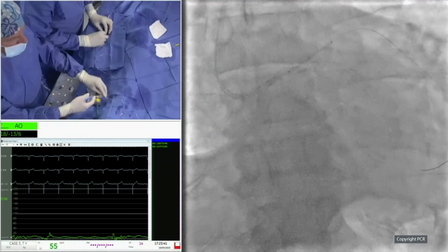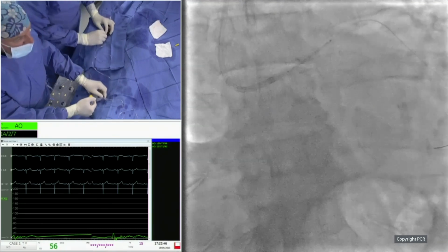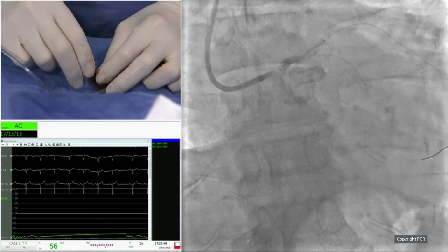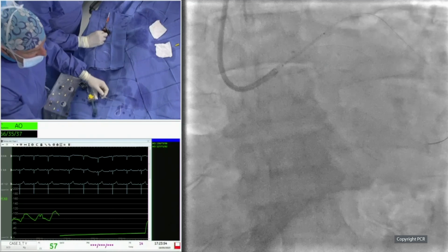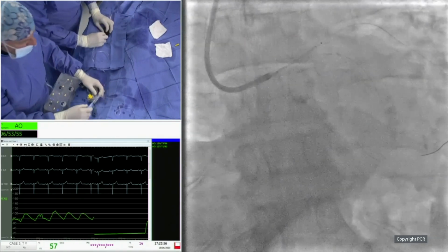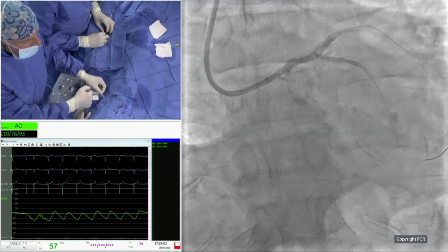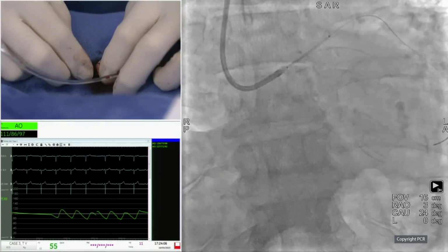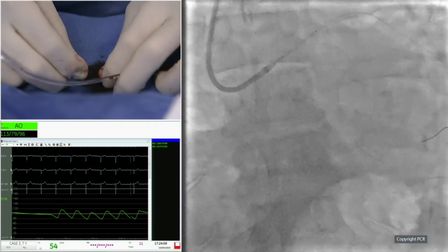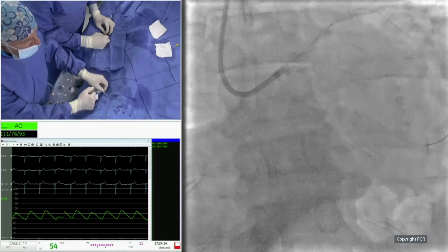The stent. So it's a 4.0 by 20 millimeter Supraflex. Maybe you have to advance it a little bit. You see, 20 was enough for me. I hope we will not have a distal dissection, but I chose the 40 due to the. Maybe we have to advance a little bit more. Yes, definitely, if we don't want to cover the ostium. Advance. We see up to the calcification, I would say. We see the image, the contrast on the top of the left main.